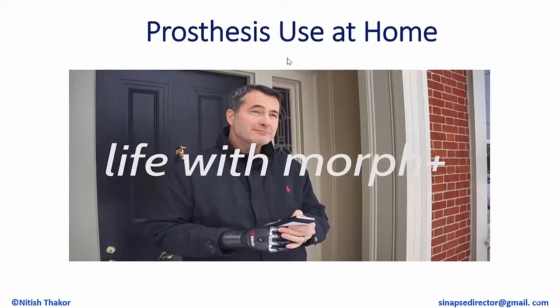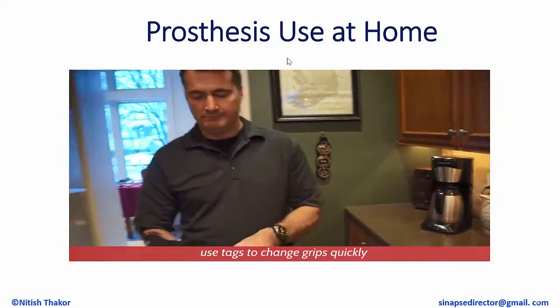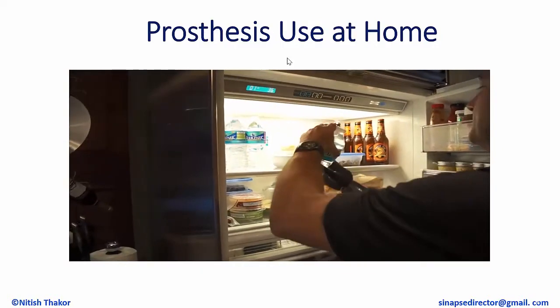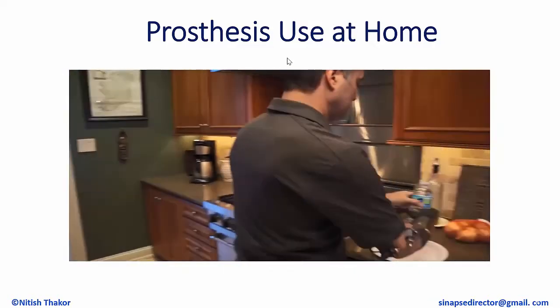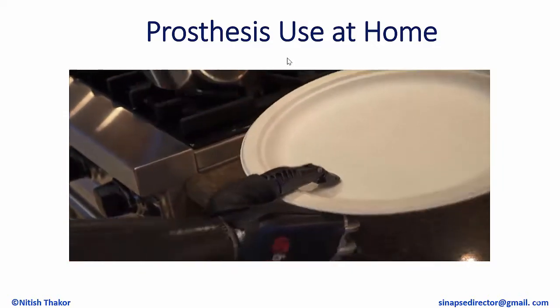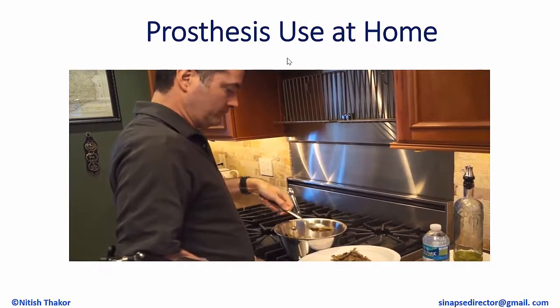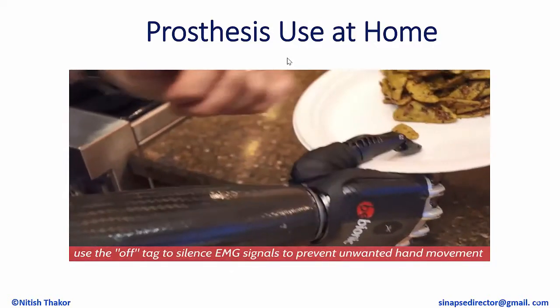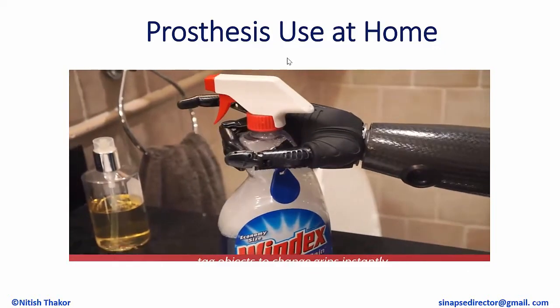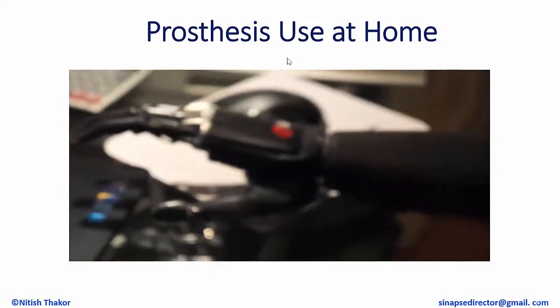Fast forward, several of my students have spun off a company that actually now makes this kind of prosthetic hand available. And this gentleman, for example, can now use it around the house. He's able to operate the wrist and the hand and the finger and grasp and function in what's called activities of daily living. So I think this is very good. It's affordable in the sense that these things still cost $30,000 to $50,000, so that's not for everyone around the world. I'll talk about it at the very end. But at least something magical, amazing, which is the hand, which is unique to us humans or perhaps non-human primates, is now under our control.